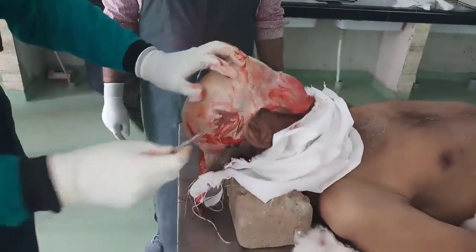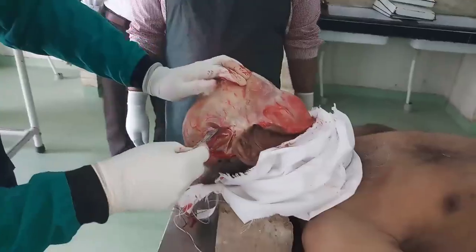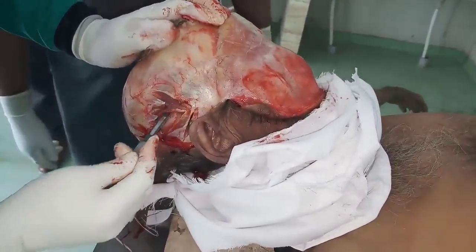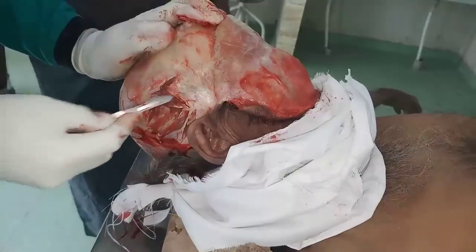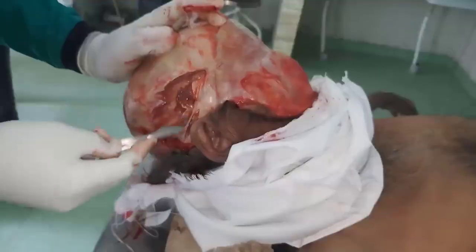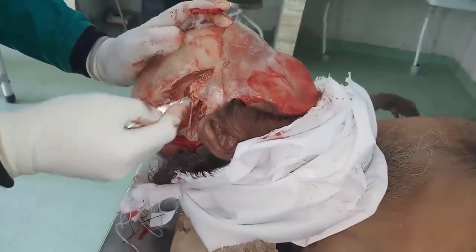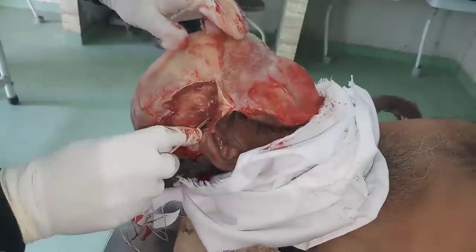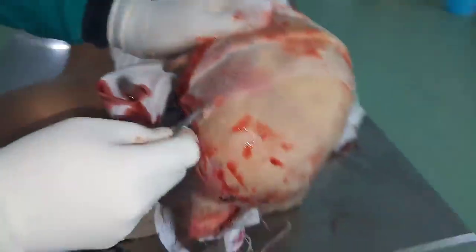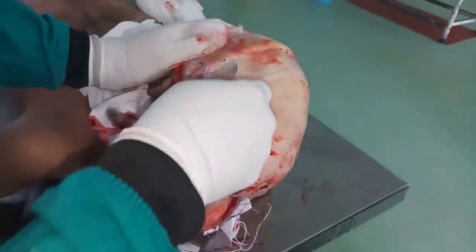Now the next step is to identify the temporalis fascia. This is the temporalis fascia. Underlying is the temporalis muscle. We will cut the temporalis muscle and fascia like this. By this swipe of the knife, the temporalis fascia and temporalis muscle are cut. Similarly, on the other side, we'll cut the temporalis muscle and the fascia.